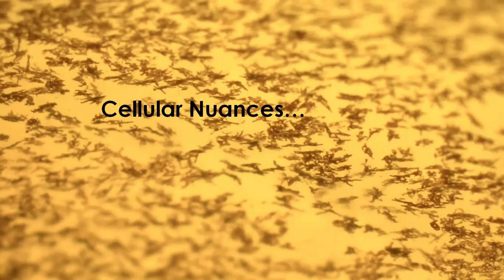Now, cellular nuances, this is a very important thing. What I wanted to highlight is that in brain tissue, there are about 86 billion neurons. But till now, we do not know how many uveal cells there are in a human being, what the types, shapes, sizes, and configurations are. You see, we know from the literature that uveal melanoma or uveal nevus arises from dendritic cells of the uveal cells. So this pattern recognition is very, very important, and we need to map them in a better way.